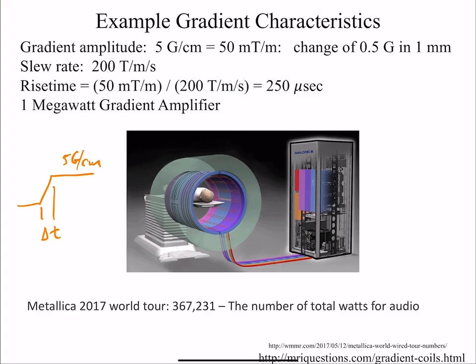We're always switching these gradients on or off. If we didn't have gradients, there'd be no noise for the most part. So the loud sounds you hear are these gradients switching on and off. Okay, and these are driven by these really huge amplifiers.